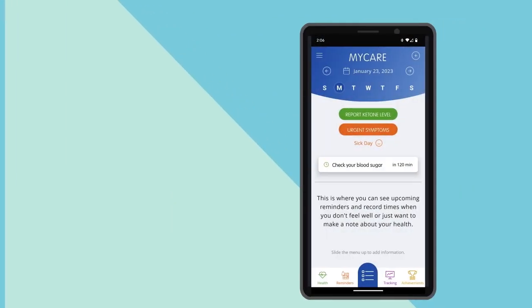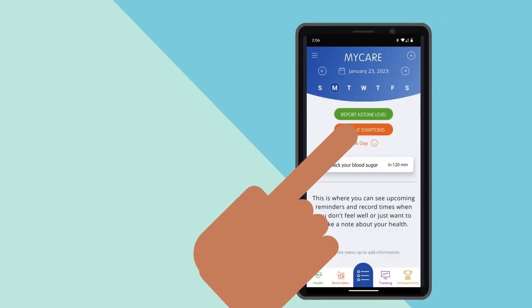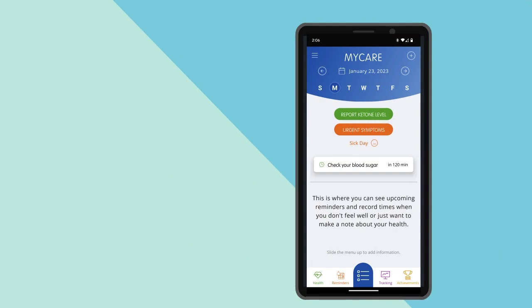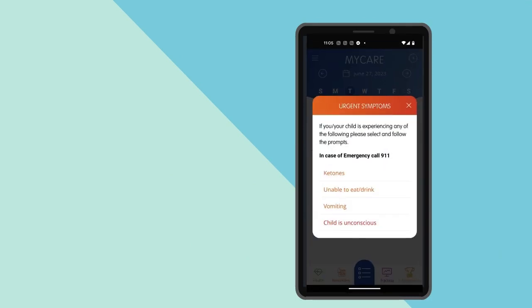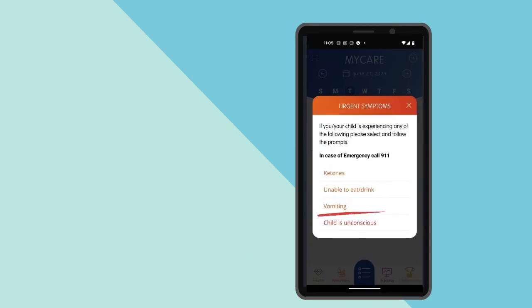You can also click the orange button to enter urgent symptoms to quickly know how to act when you or your child has ketones, is unable to eat or drink, vomiting, or unconscious.